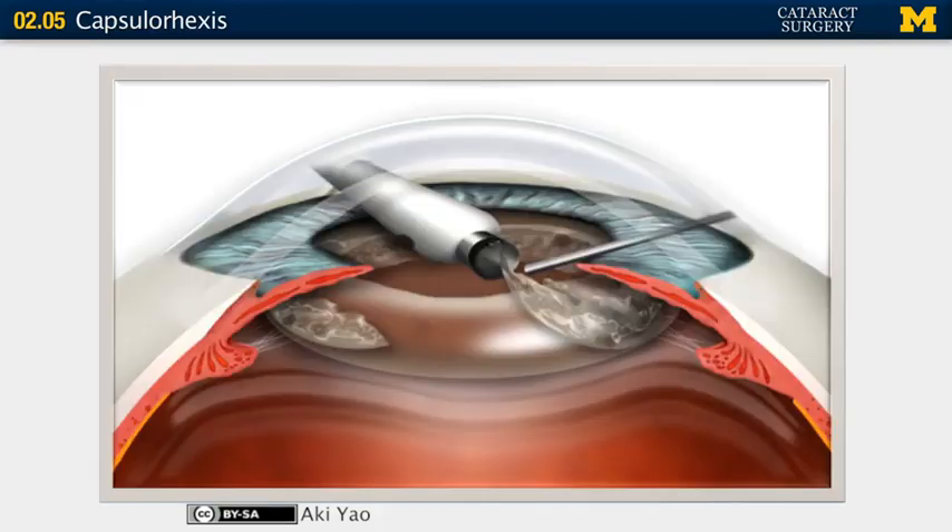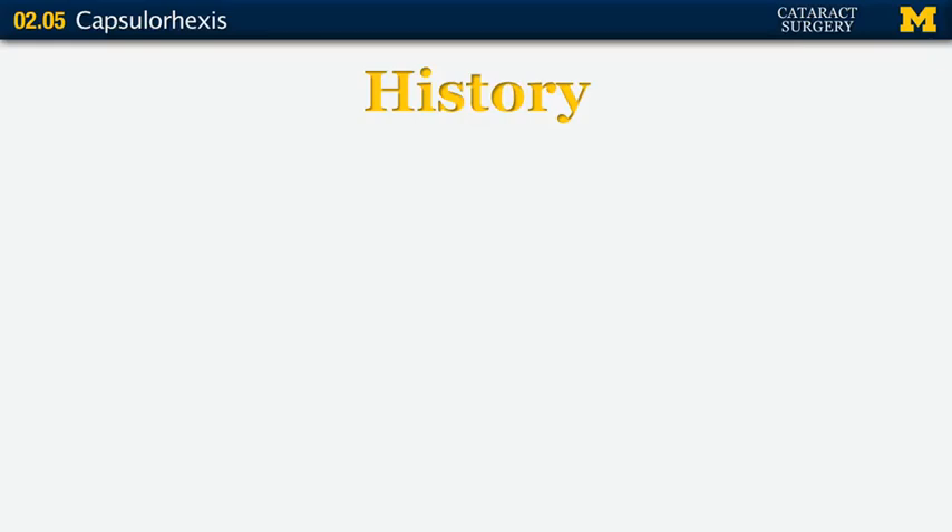The goal is to make a nice round opening in the capsule so that you can insert your instruments into the bag, clean out the lens, and place the IOL into that bag.